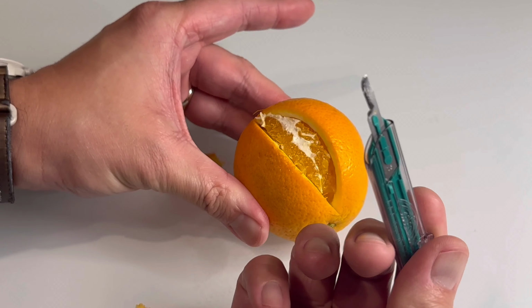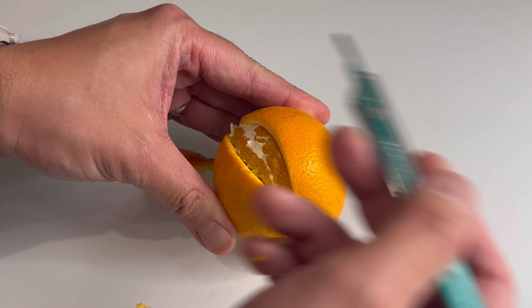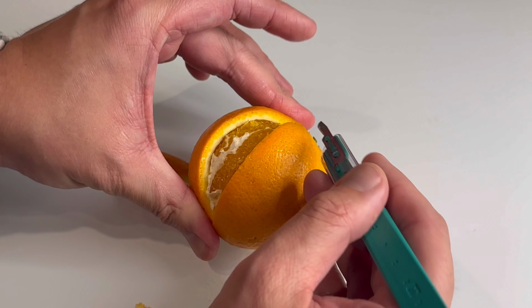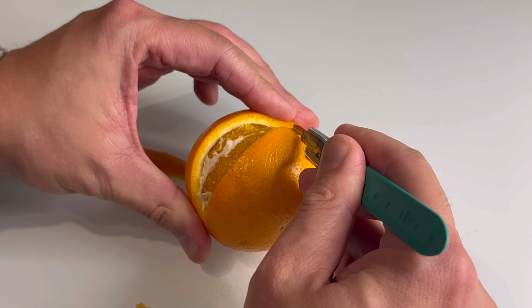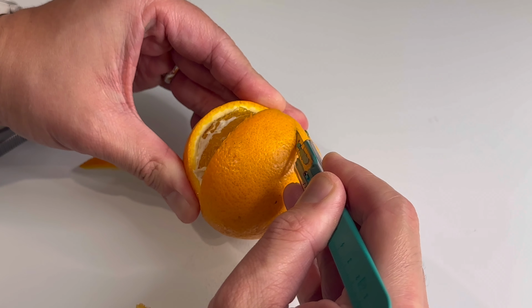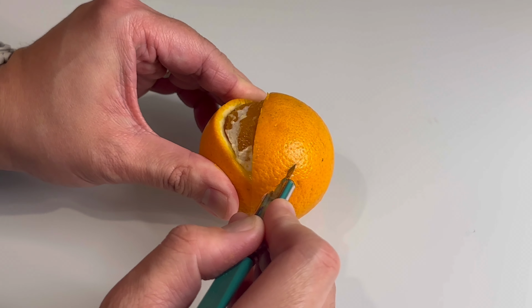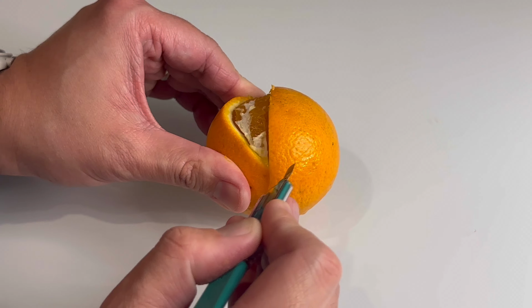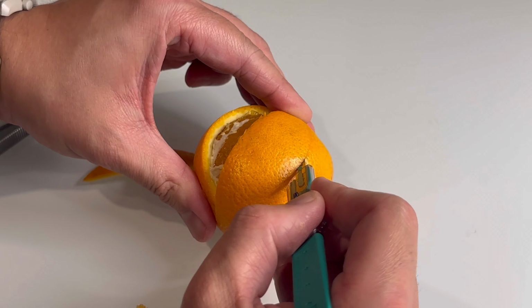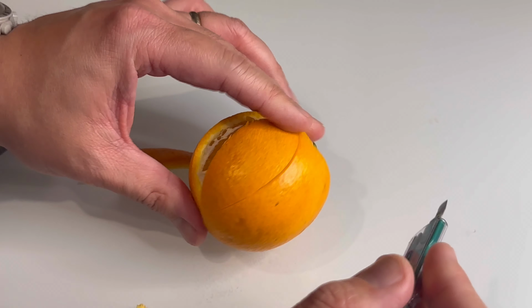You could use both the knife and or cautery to do something similar. Let's say you're excising a lipomatous mass following the tissue planes. You need both proper retraction to expose it, so that when you cut the attachments you're able to leave the tissues fully encapsulated and follow that plane of dissection.